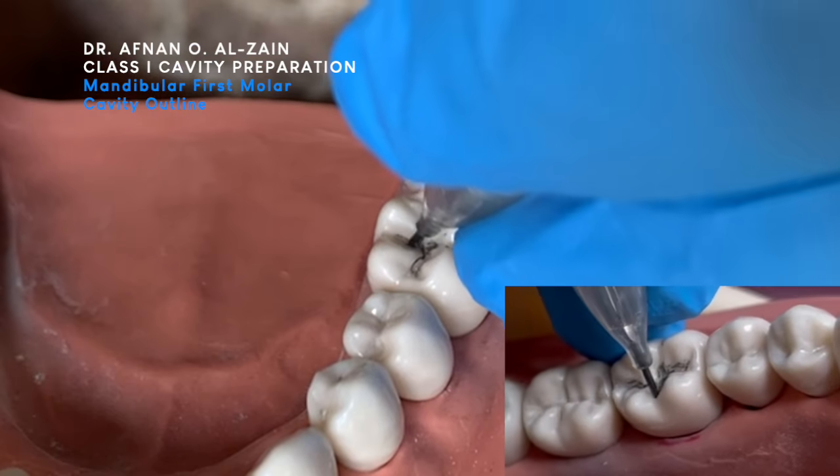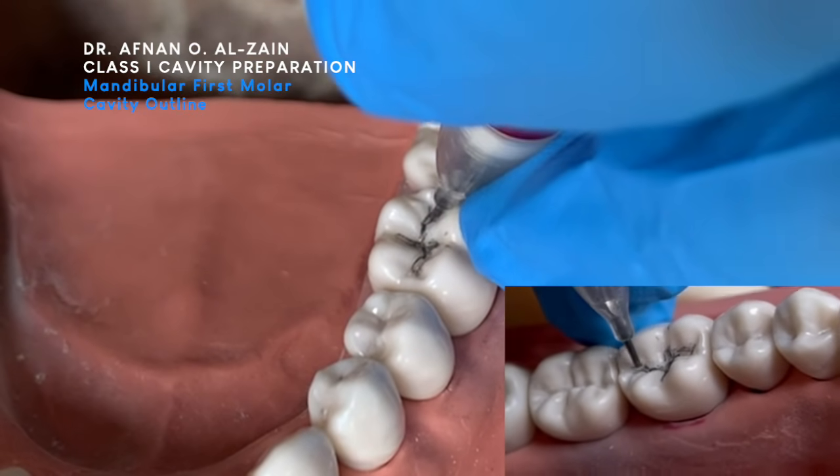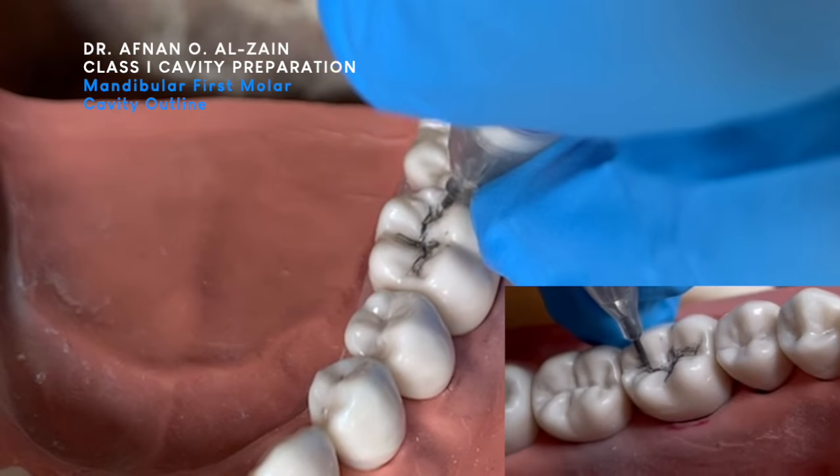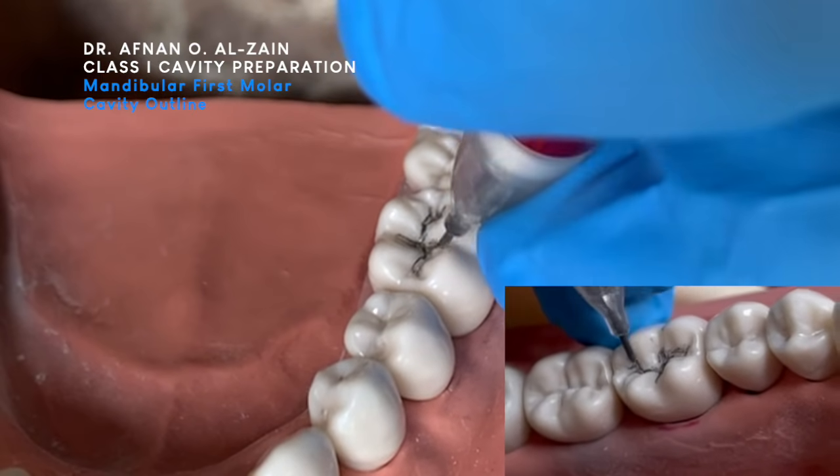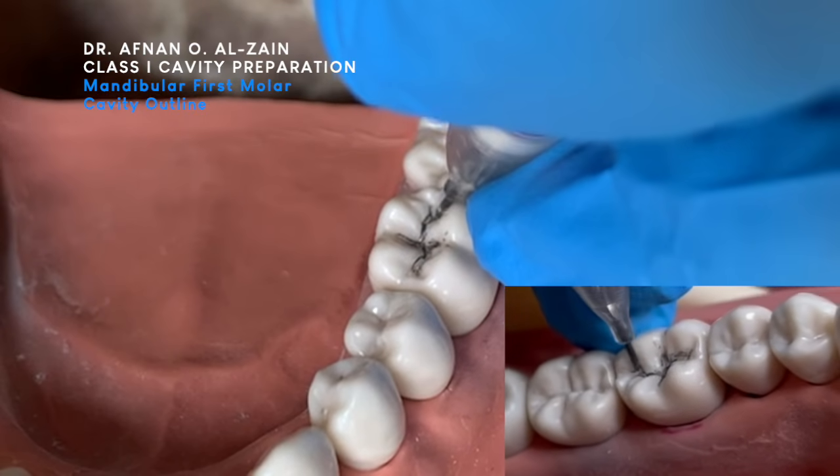And then we will go to the lingual. The last thing — we go to the distal groove. We don't forget the 6th has 5 cusps, so we have to go here in the buccal groove and then we go to the distal groove.